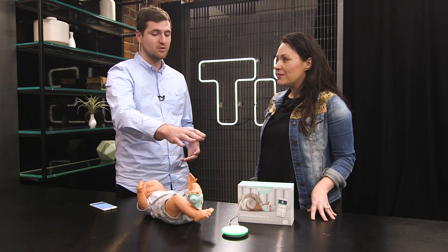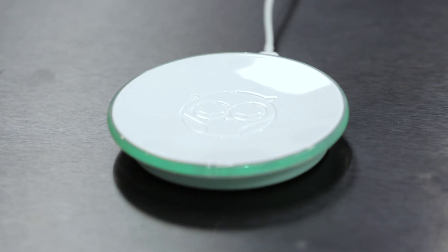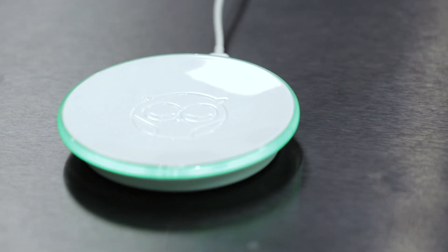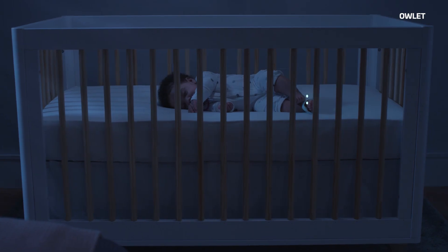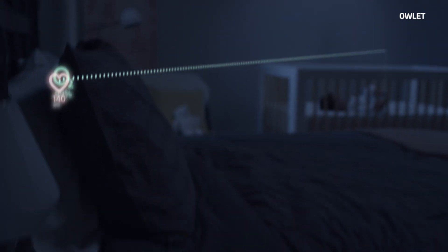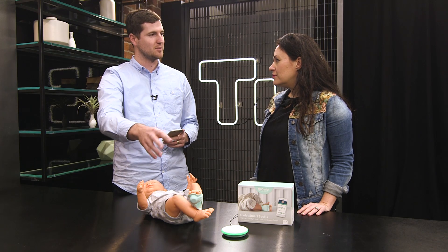It communicates through Bluetooth to the base station. The base station sits on your nightstand and will glow different colors and sound alerts if something changes, then it sends all of your baby's vital sign information to your smartphone. Green is good, red is bad, and yellow means check sock placement.